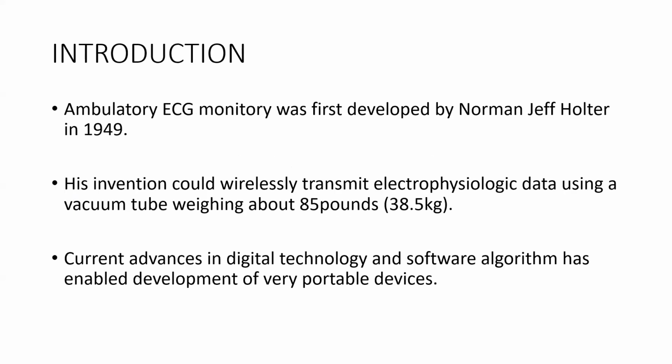So we all know that cardiovascular disease is one of the leading causes of morbidity and mortality worldwide, and arrhythmia plays a significant role in this morbidity and mortality. Some arrhythmias are short-lived and cannot be captured by our standard 12-lead electrodes that only record cardiac activity for about 10 seconds. So there was a need for the development of ambulatory ECG.